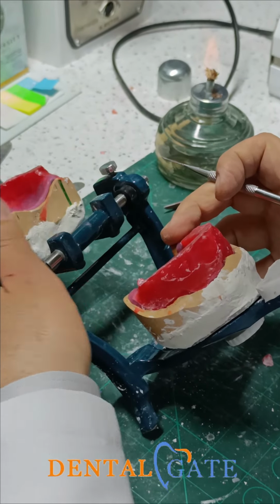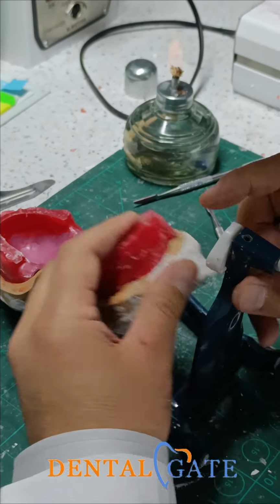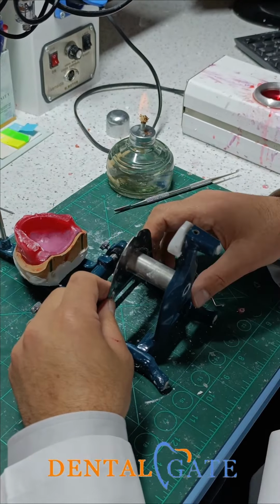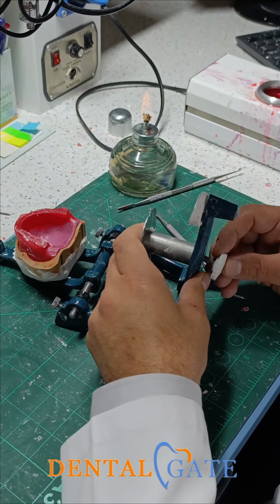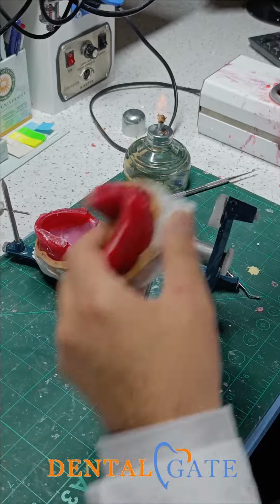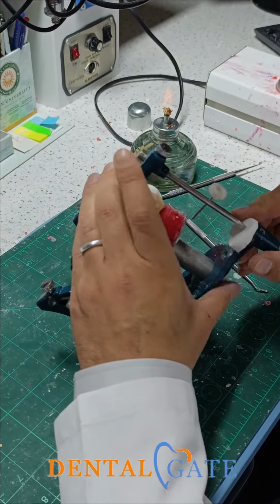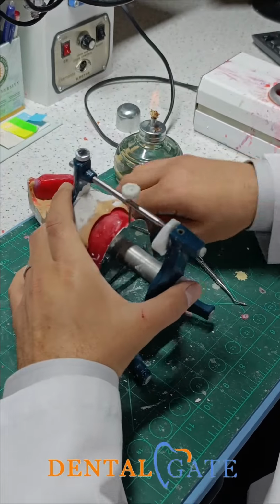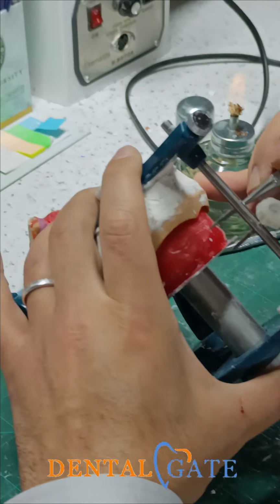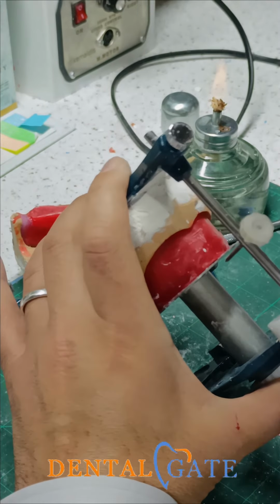Okay? So regarding the occlusal plane, in the laboratory we have a table. We will put the table in the articulator. We can remove the lower from the upper. Okay? And as our objective now, we want to arrange the teeth in accordance to the occlusal plane.